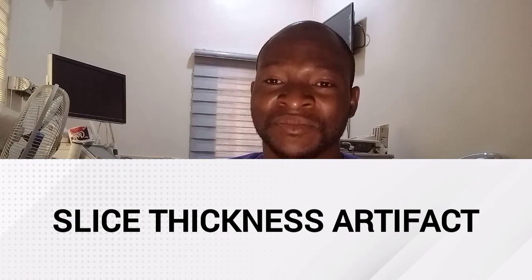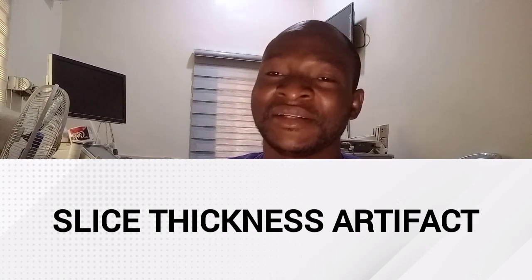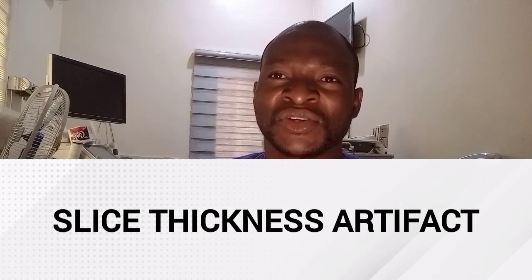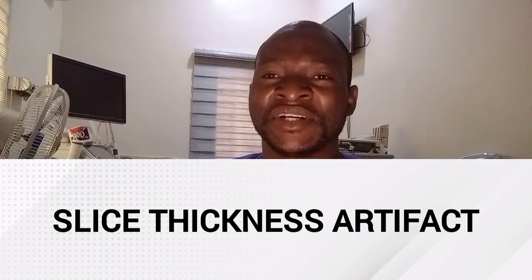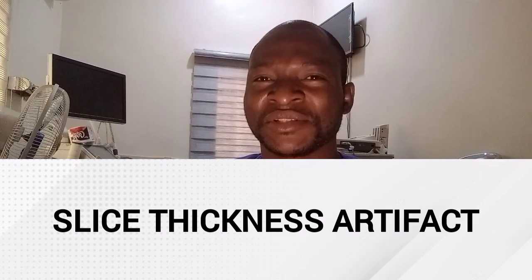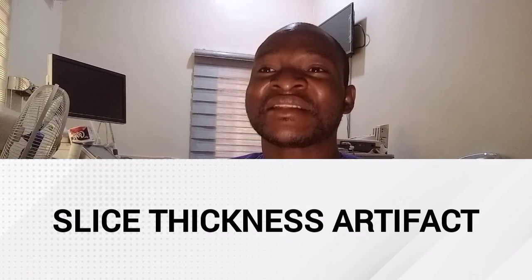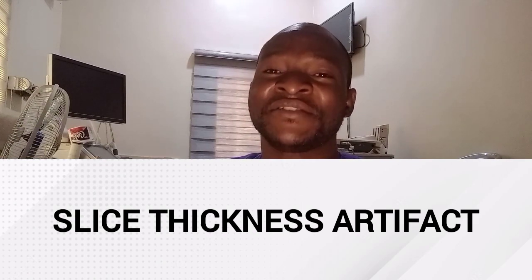But both look identical and can be minimized in a similar fashion. Its occurrence can be diminished using a correct transmit focal zone, making the slice as thin as possible. It is also called section thickness artifact or volume averaging.